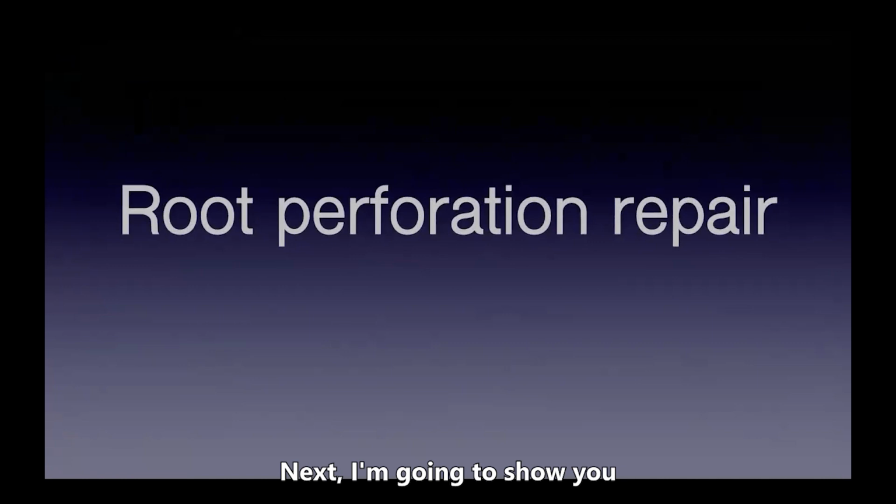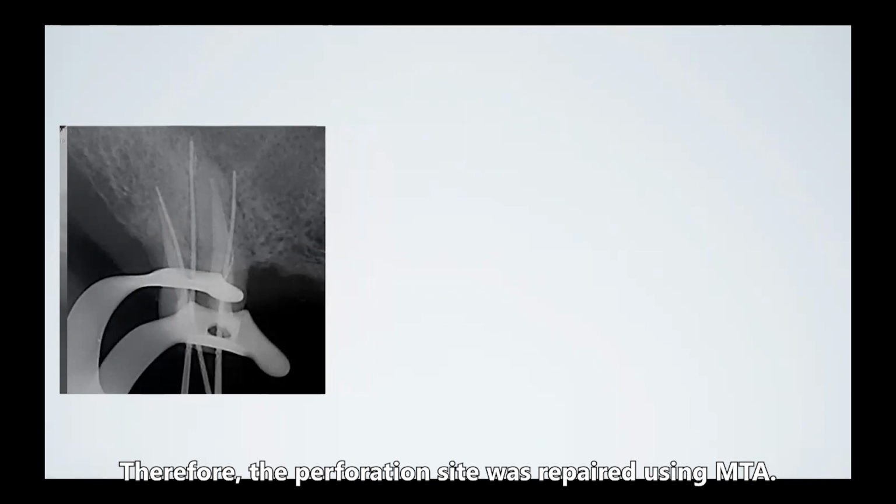Next, I'm going to show you some perforation repair cases. The maxillary second molar needed root canal treatment. After access cavity preparation, during the working length determination, the perforation was recognized. Therefore, the perforation site was repaired using MTA.